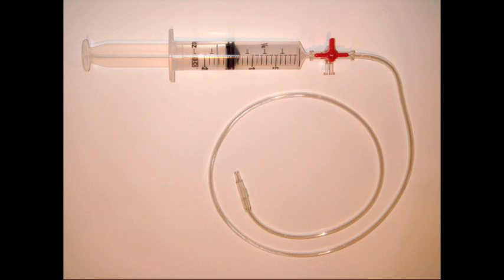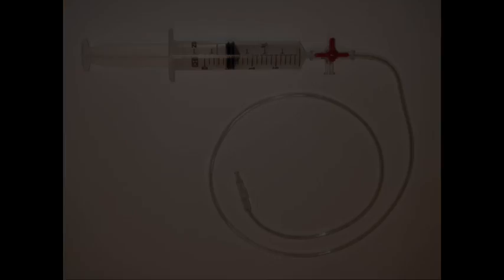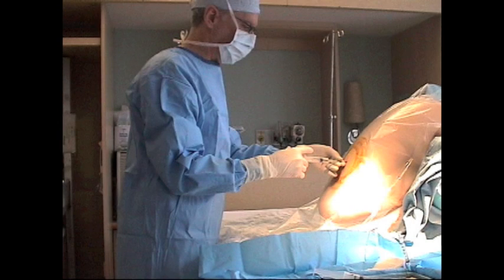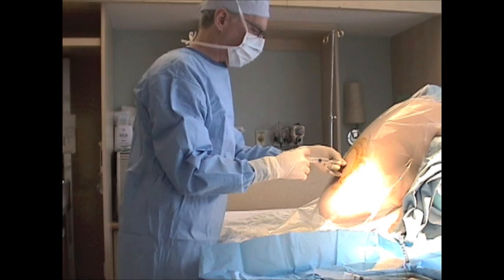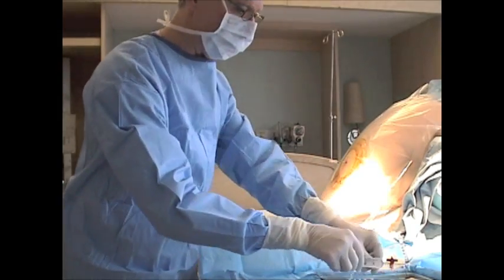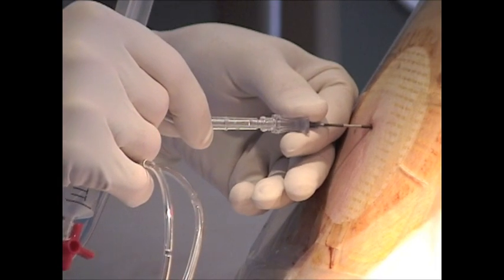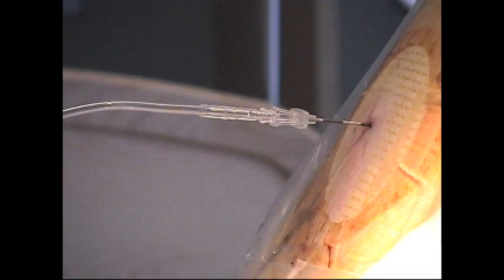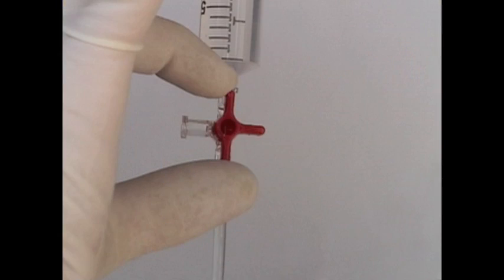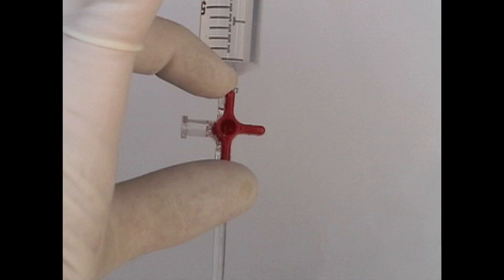Prior to insertion of the epidural needle, the syringe and extension tubing are primed with the analgesic or anesthetic medication of choice. The epidural space is identified using the method with which the operator is most familiar. Next, the tip of the extension tubing is firmly attached into the hub of the epidural needle. The stopcock is then turned to isolate the syringe contents and to expose the fluid within the extension tubing to the atmosphere.